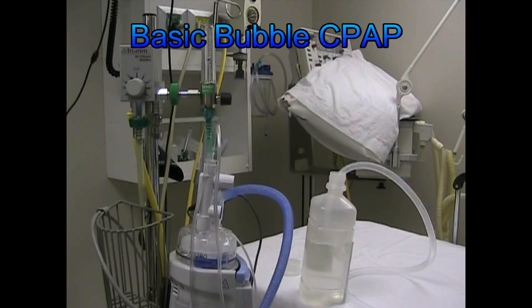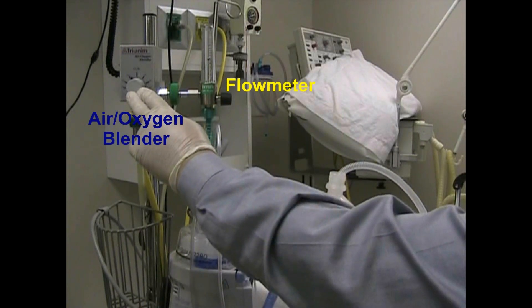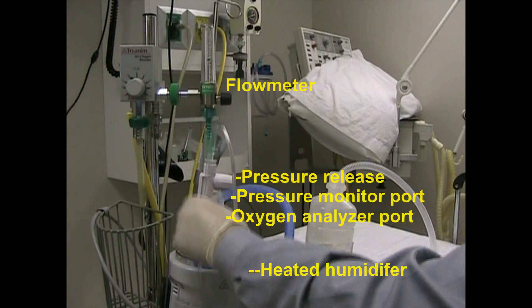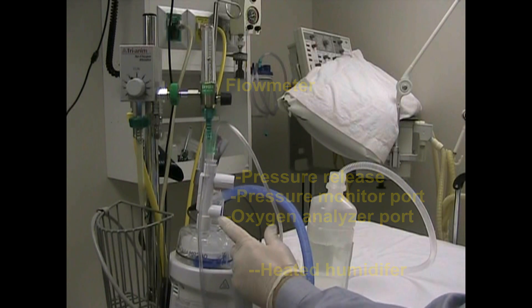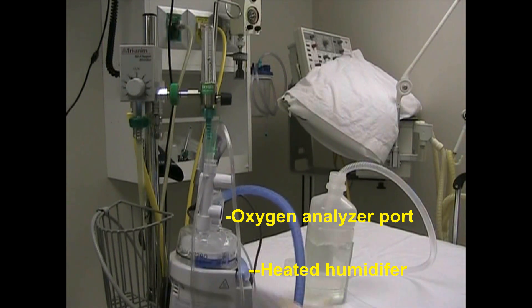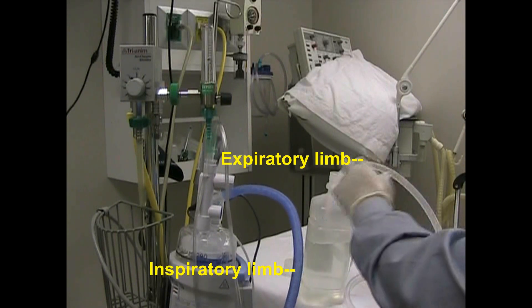Originally, bubble CPAP was nothing more than a tube stuck in a bottle of sterile water. We have a blender to give us a specific amount of oxygen, a flow meter that goes down to a pressure valve system, a port for pressure reading, and a port for the oxygen analyzer. Then to a humidifier, onto the baby's nasal prong system, and then the exhalation goes into the bottle.